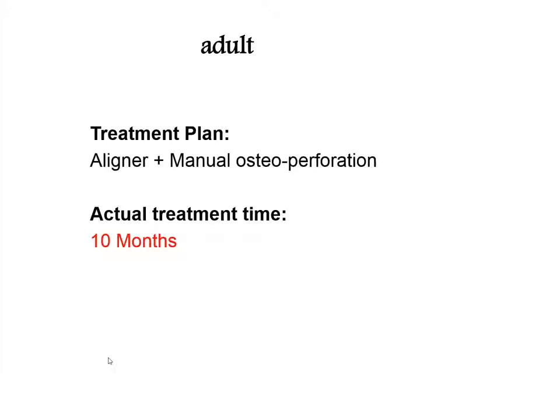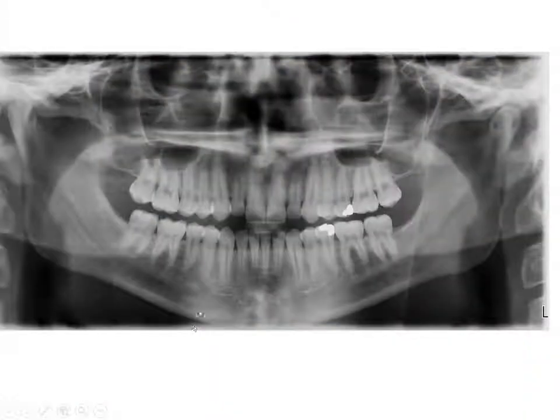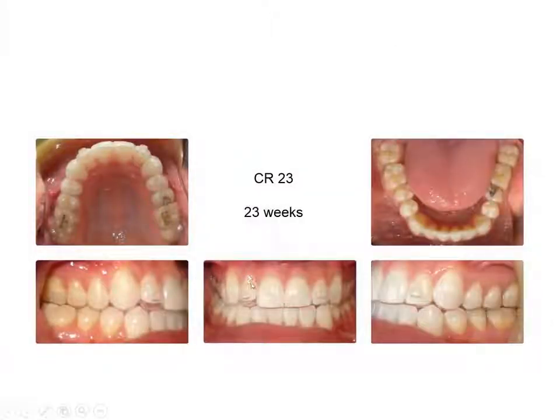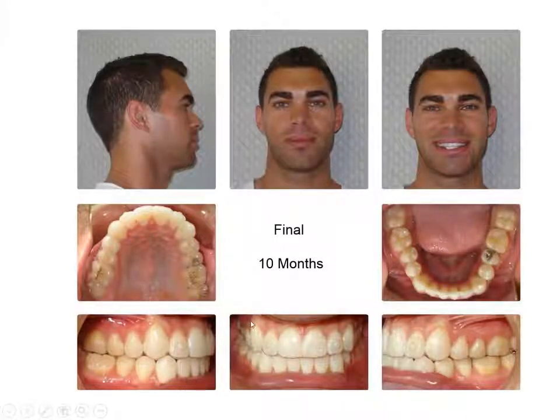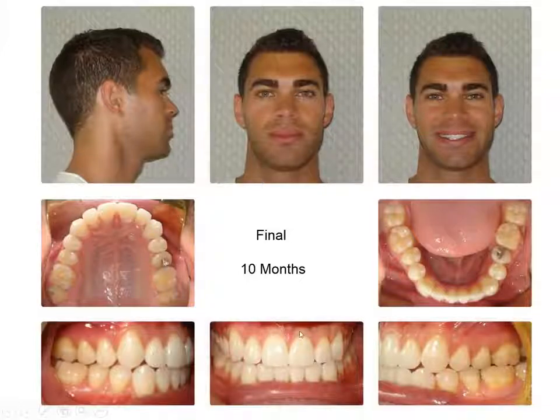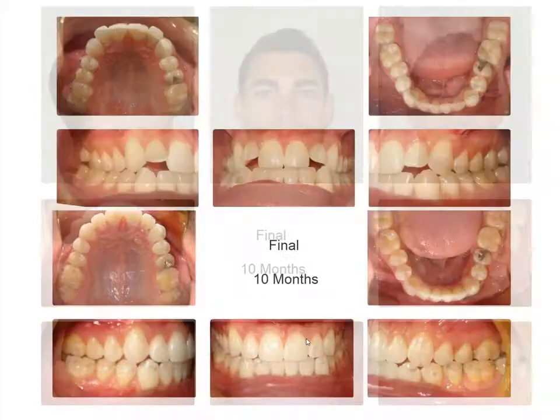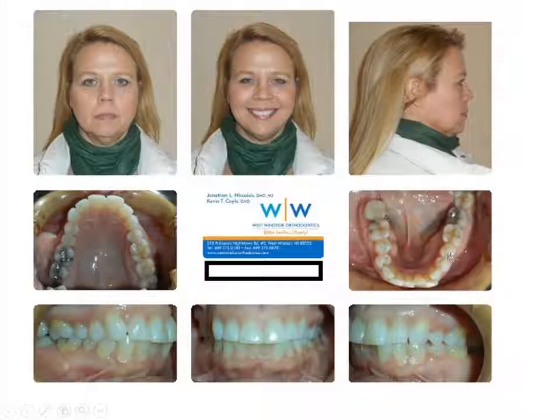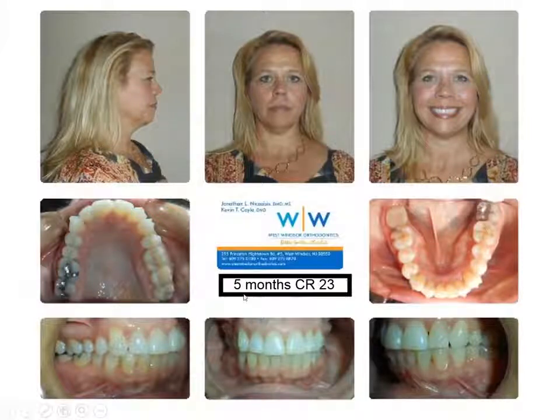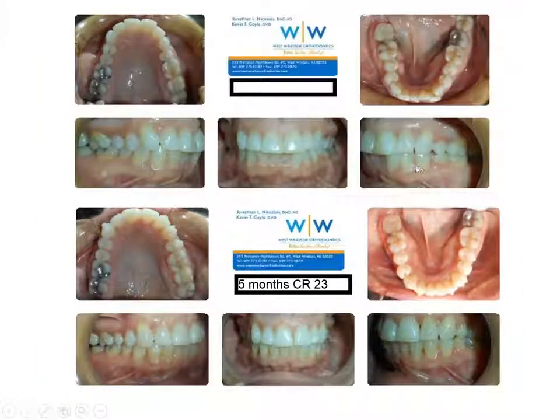Next patient — ten months, getting stubborn laterals to erupt properly. Two perforations on either side around the laterals. The ClinCheck was not designed optimally — improper extrusion initially — but refinement got it back on track. High frequency vibration might have improved tracking. Done in ten months, perforated twice mesial and distal around the laterals. Another adult — a hygienist I treat for about $2,200. One Mops procedure, one large rotation resolved, refinement in five months — fantastic.